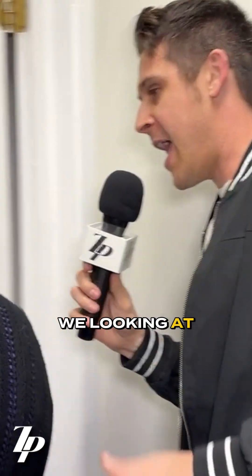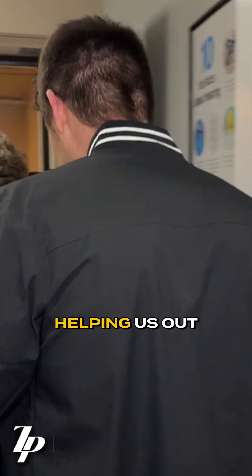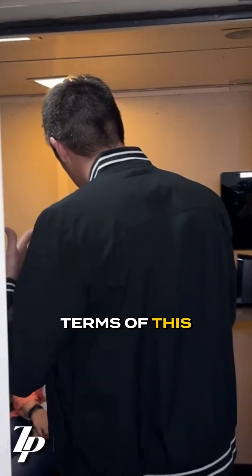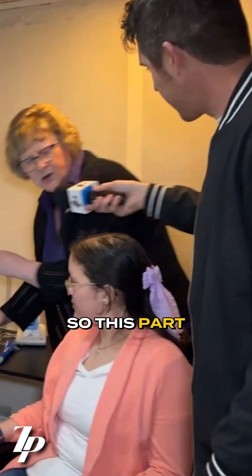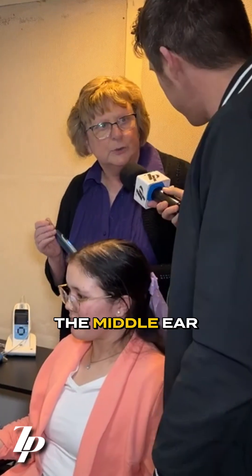So what are we looking at in here? We have a volunteer that's helping us out with this particular exercise. So what are we doing here? This part is to assess the middle ear.